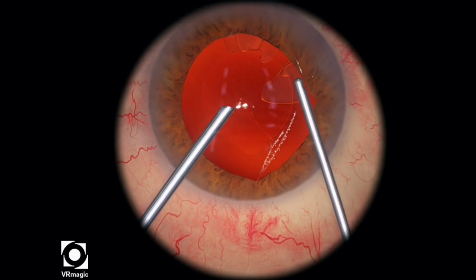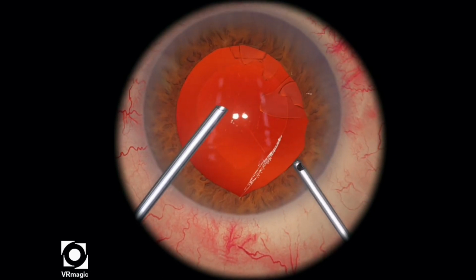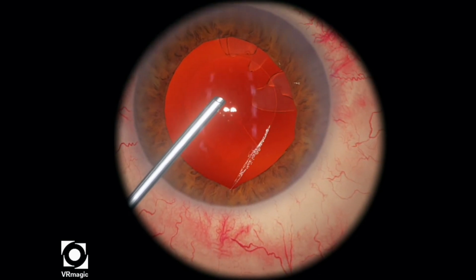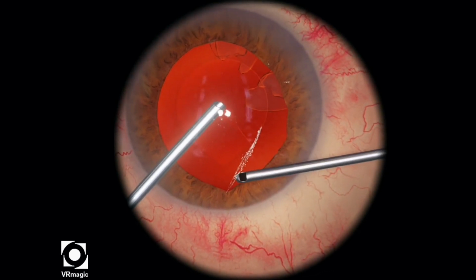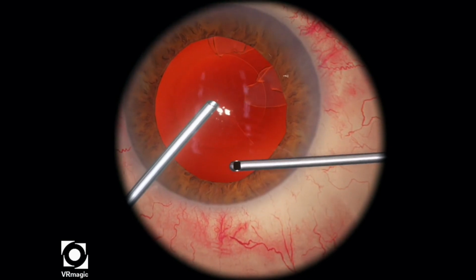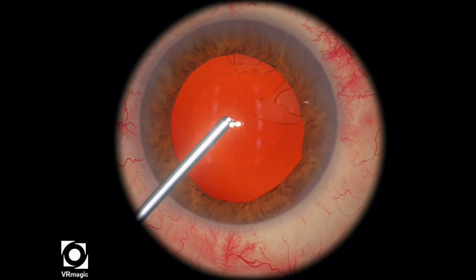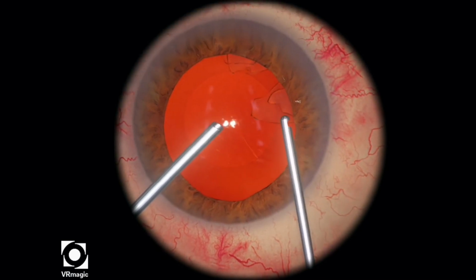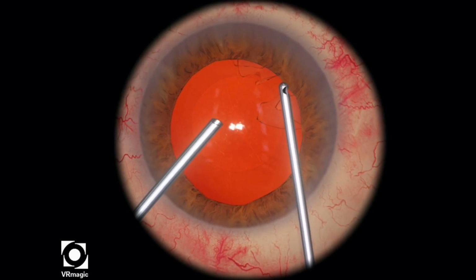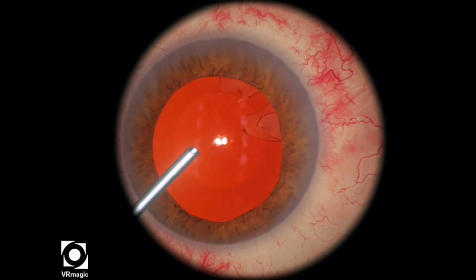This is pretty dangerous in real life. You could cut iris, you could cut capsule as well. So I don't think that this is realistic, to be honest. Using the spatula is also a little bit difficult as well, but I guess in real life, even if you touch the cornea a little bit, no one is going to yell at you and say that you've scratched the cornea, especially in a situation where you have a posterior capsular rupture. I think that's the least of your worries. So you just want to try to be as gentle and methodical as possible.